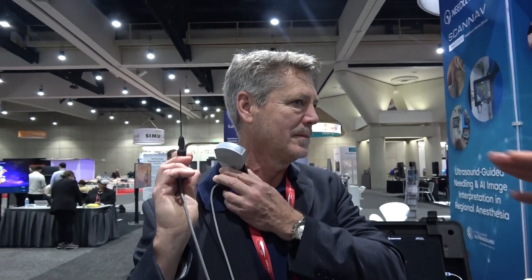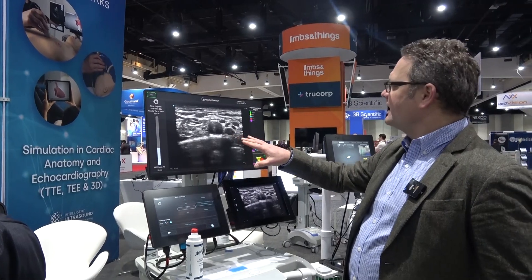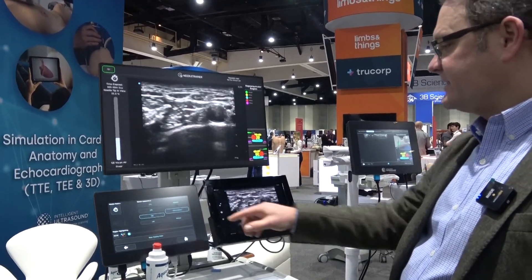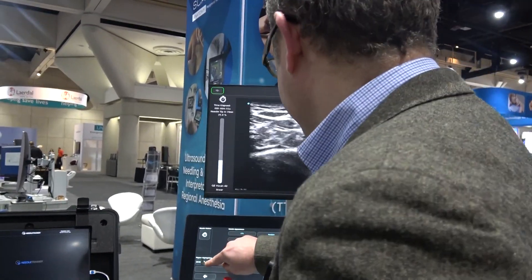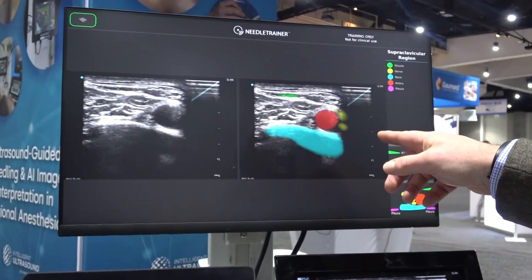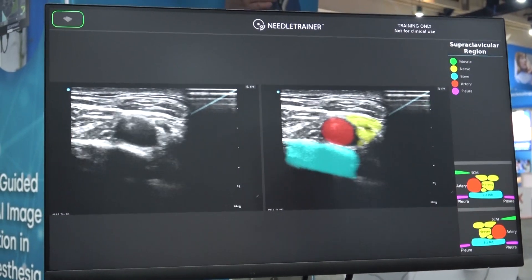The system has got an ultrasound probe so it's looking at his real anatomy. If I switch to the screen here you can see that this is what his supraclavicular region looks like. The ultrasound is reasonably difficult to interpret, but we've got AI in our system here and this AI is reading Gerry's anatomy. On the image on the left you can see the normal ultrasound, but our AI is colouring it — showing where the nerve is in yellow, where the artery is in red, where the bone is, and where the pleura is, which you shouldn't put the needle in.